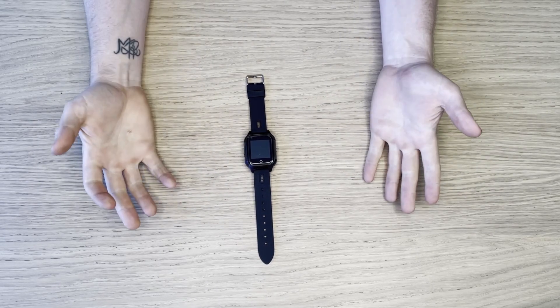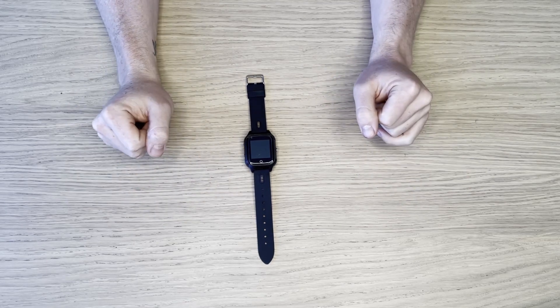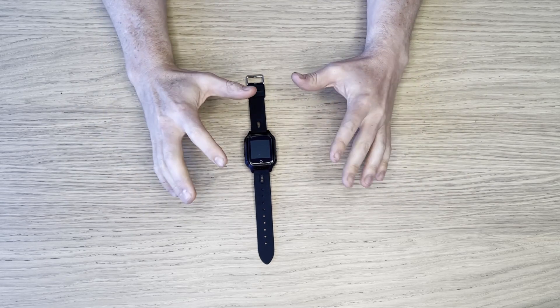Today we have our GPS Medical Alert Watch. This one has a lot of features so I'll just go over the main points.